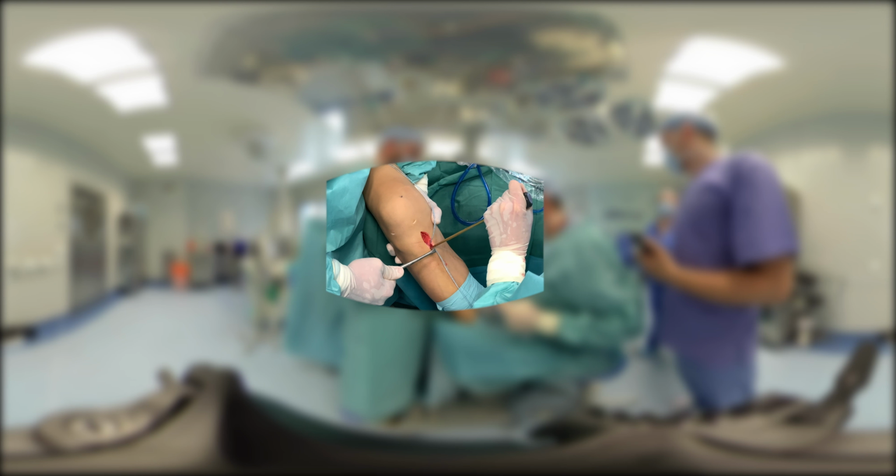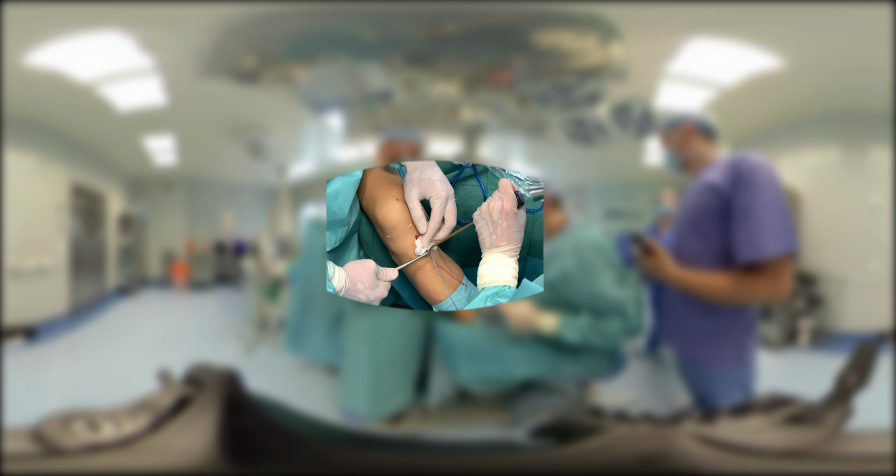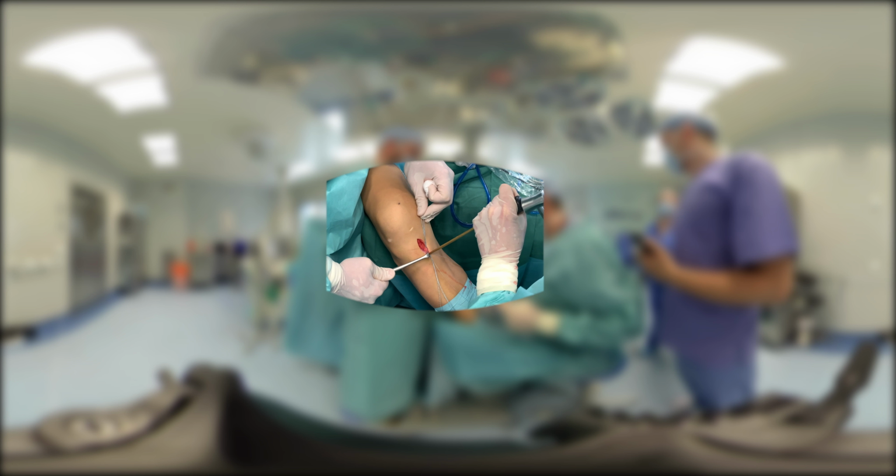Once again, just to remind you, first you create the hole for the anchor.